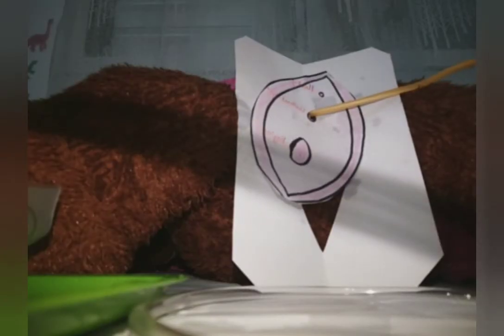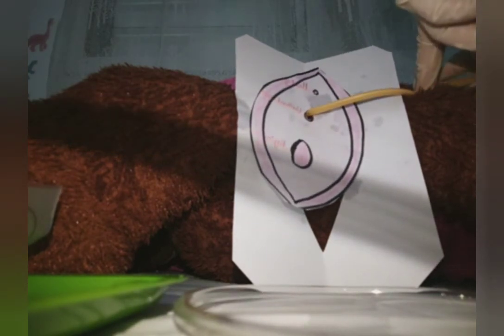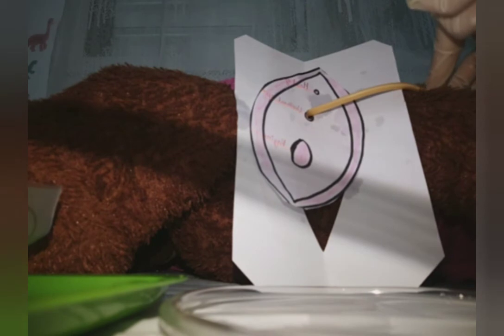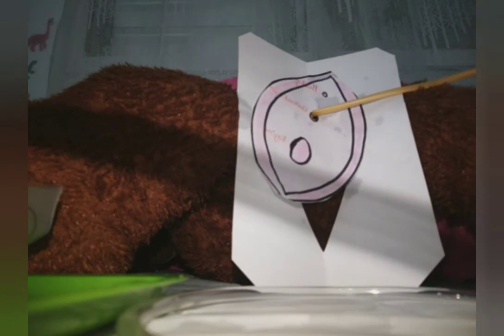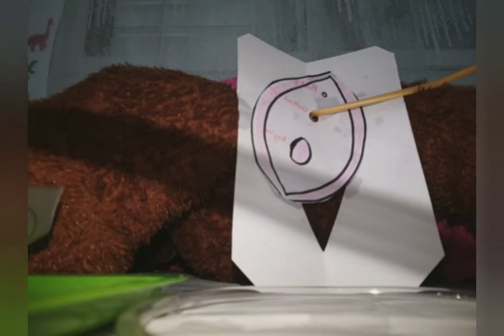Secure the catheter on the patient's inner thigh to prevent tension and pressure on the urethra, and secure with the plaster or the strap so that it will not move. And I will ensure that the tubing is not kinked, and secure the drainage bag to the bed frame below the bladder level. So if you put it above the bladder, above the abdomen, there can be a backflow of the urine. So you should always put it below the abdomen on the bladder side, on a non-movable part of the bed, on the bed frame, not on the bed railings. Hang the drainage bag on the bed frame on a non-movable part.